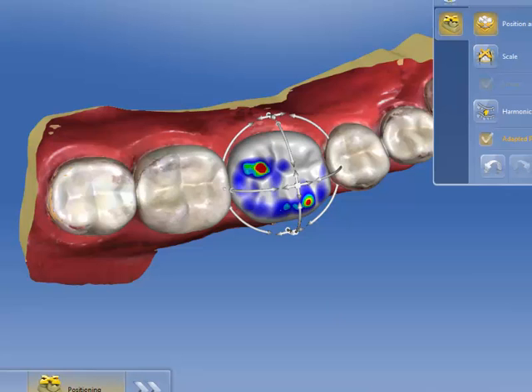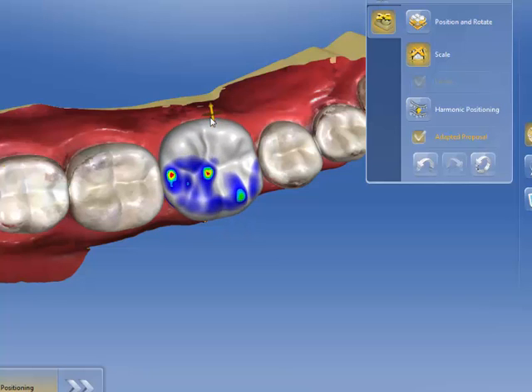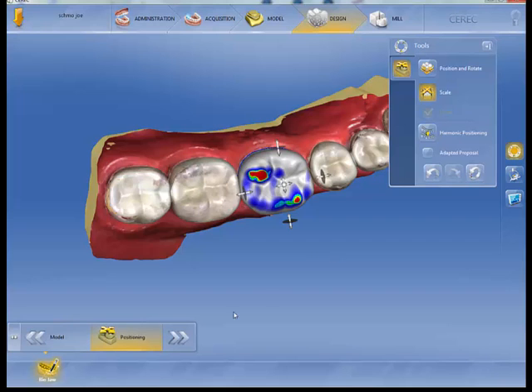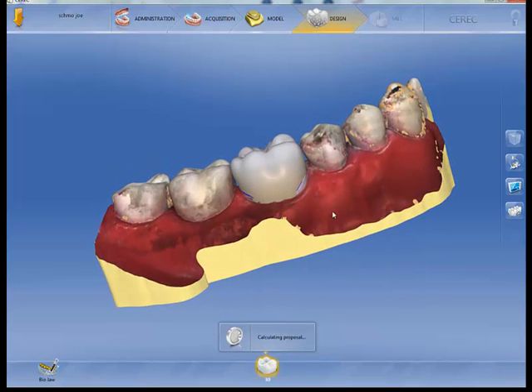When I go to the tools, I'm positioning and rotating — I can even scale it if I'd like to. I'm going to move all these around, and after I get it positioned the way I want it, I'm going to click Next. As you can see, it leaves the tooth in that location.